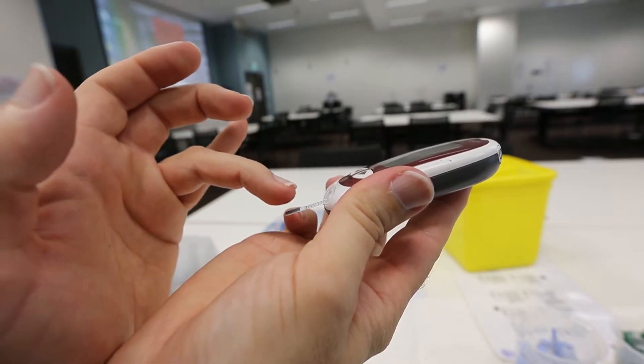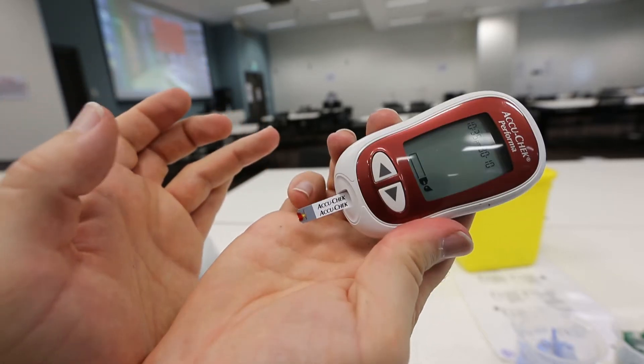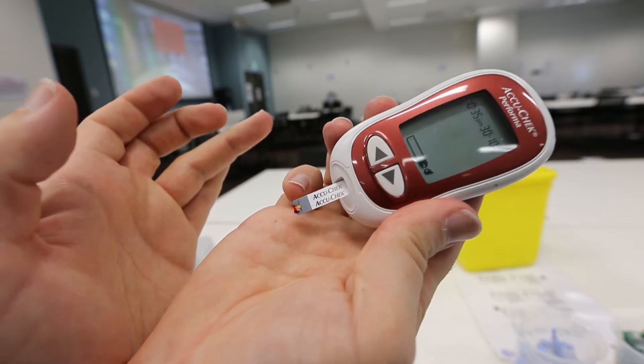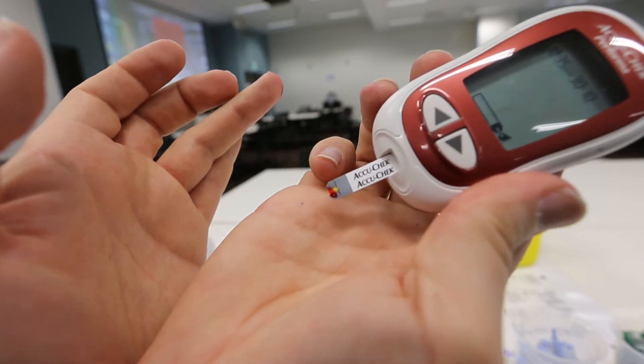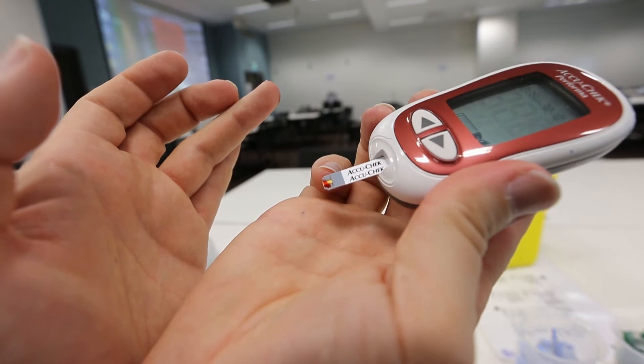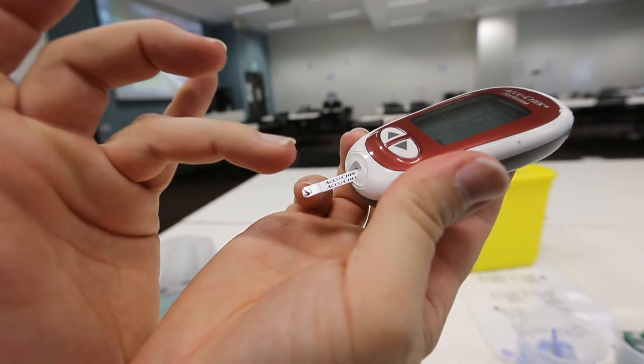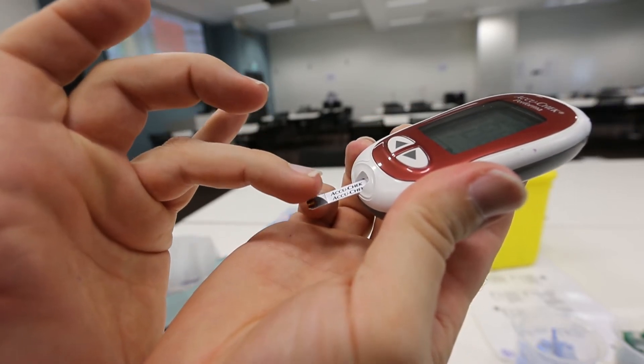Similarly, don't dab blood on top of the yellow test strip with your finger. As I said before, there is a plastic film over the top of the yellow test area, and so if you dab blood from the top of the test strip, the blood will not reach the test area.